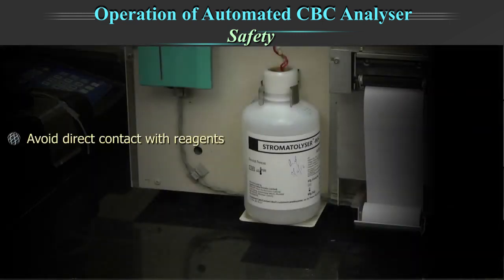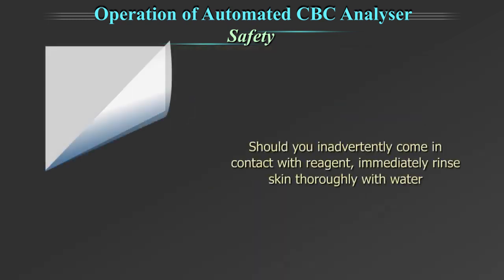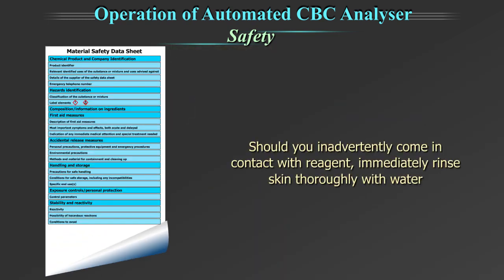Avoid direct contact with reagents. Reagents can cause irritation of the eyes, skin, and mucous membranes. Should you inadvertently come in contact with the reagent, immediately rinse skin thoroughly with water.